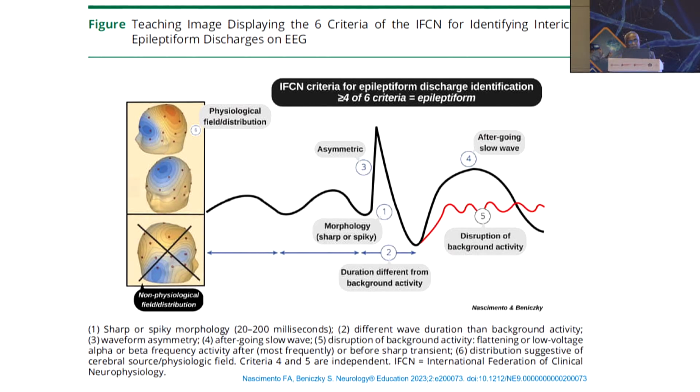In the absence of that, there is no need of rushing. You preferably consult somebody more experienced than you before making a conclusion, or try to get a longer record. You have to define it better, because there were only very few sharp transients during the routine awake recording. So try to get a sleep recording, or many a time an overnight EEG, before you make a conclusion.